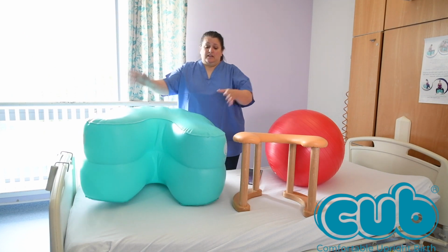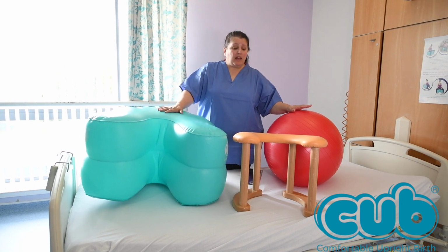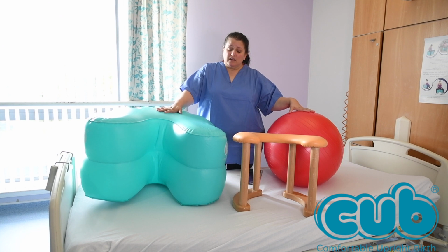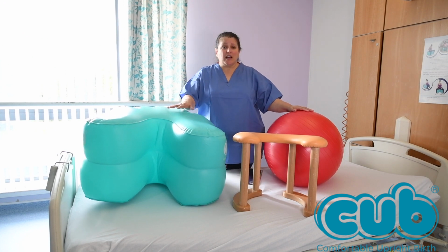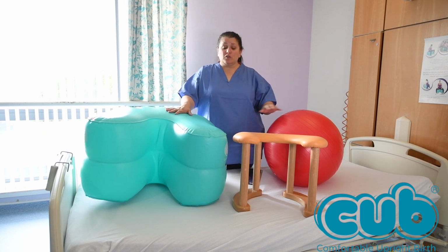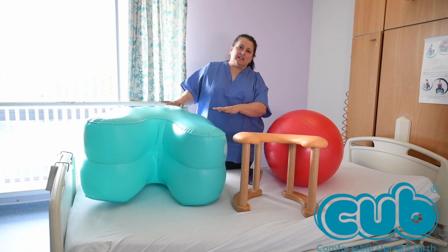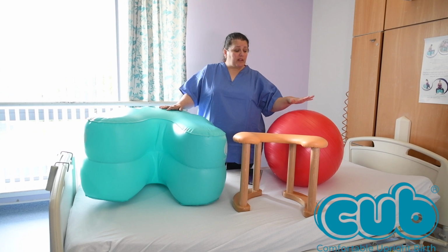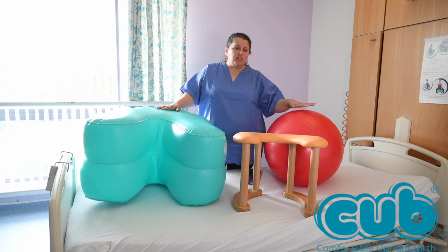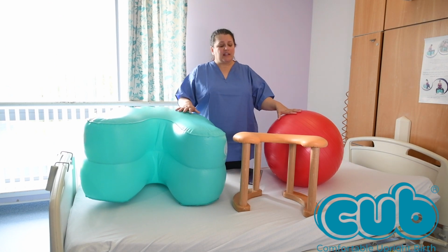However, it does have all the advantages of being comfortable because it's inflatable. It has the same advantages as the ball in terms of it's very lightweight, it's easy to transport. Compared to something like a birth stool, it's relatively inexpensive, although more expensive than a ball, but it is a completely different product. So that's the difference really between the ball and the CUB. The other thing to mention is the ball can only be used by those who are able to balance against it. That's not actually the case with the CUB, but we'll go on to that as well.